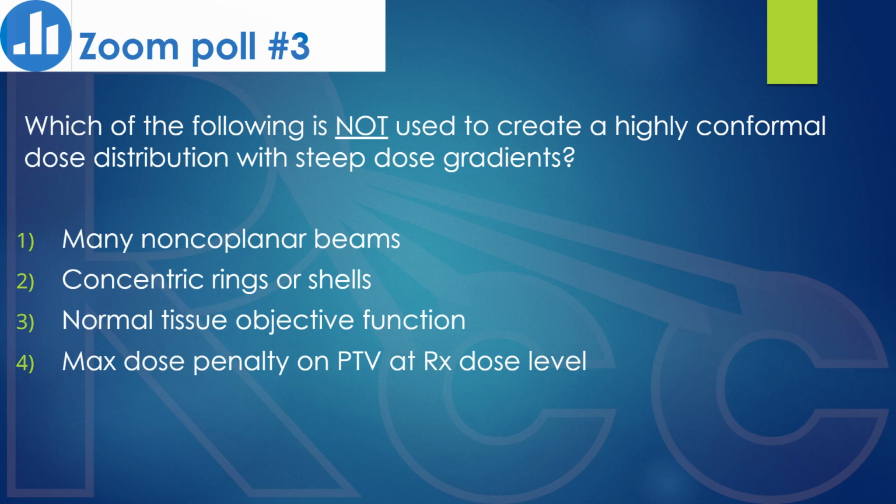And so within this question, there's kind of this implicit understanding that if you use one of the recommended techniques, that you're using it well. And there's also the possibility of using these other techniques and not getting the settings quite right and not having good dose conformity. That's also true too. But there's one of these techniques that always works against the dose gradient. And that's really what I'm after with this question.